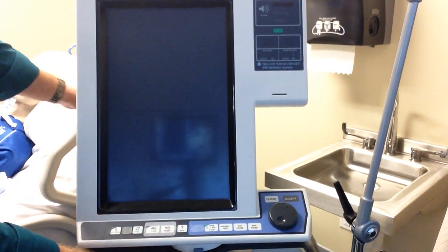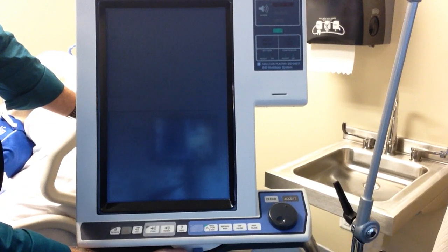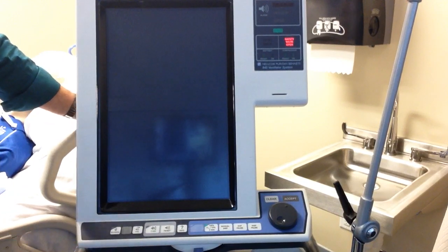Today we're going to be setting up the Puritan Bennett 840 in the SIMV and volume control mode, or the assist control mode. Depending on the ventilator you're using, the assist control and volume control are the exact same thing.